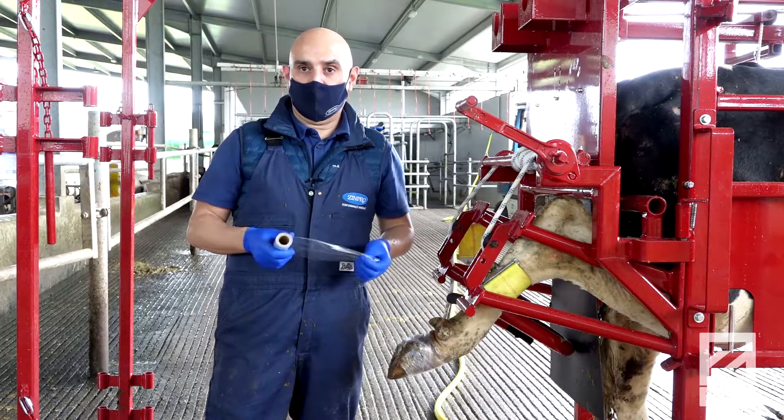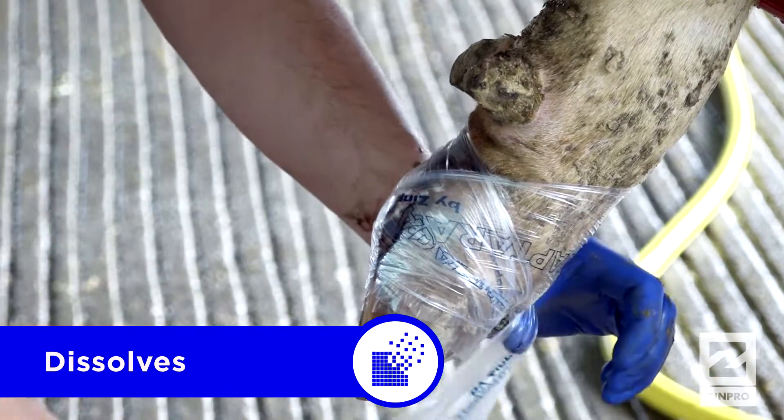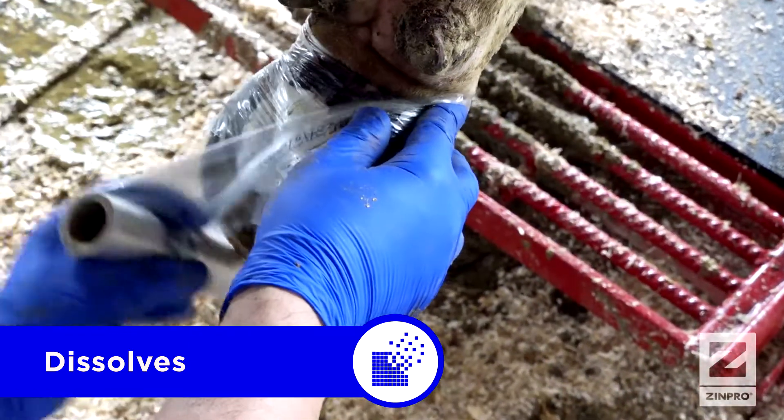How do you apply the bandage? One can basically choose an approximate time of permanence for the wrap — it will all depend on the number of turns you do.